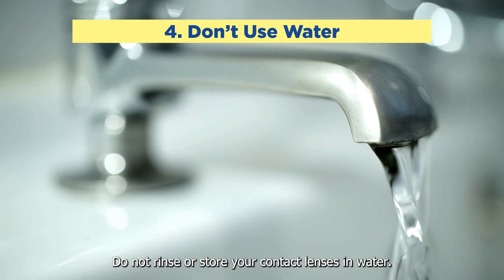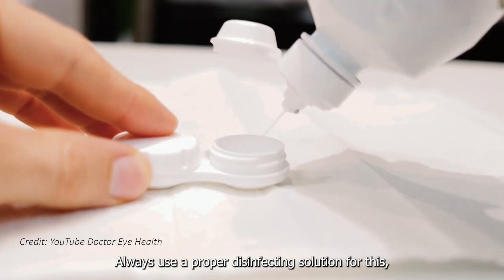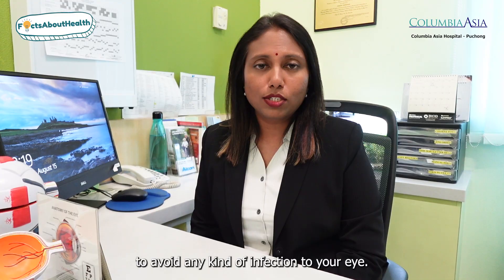Number four: do not rinse or store your contact lenses in water. Always use a proper disinfecting solution for this, to avoid any kind of infection to your eye.